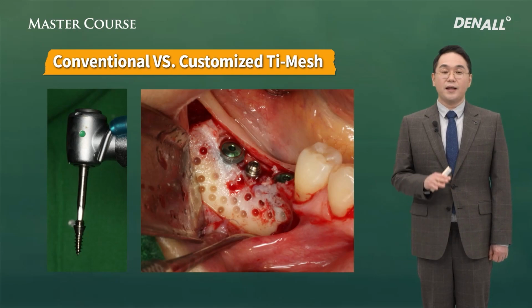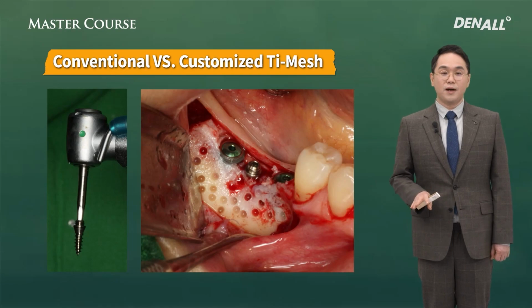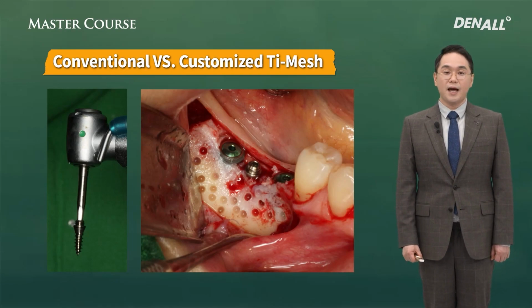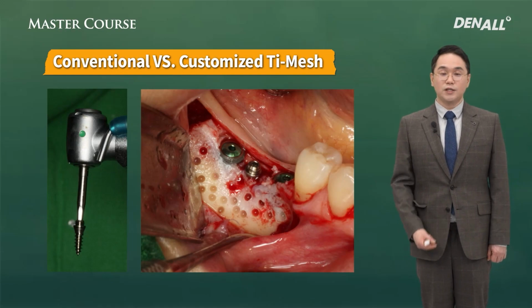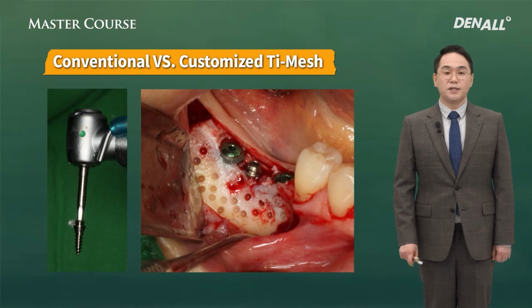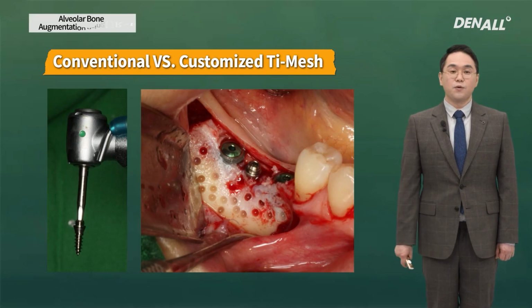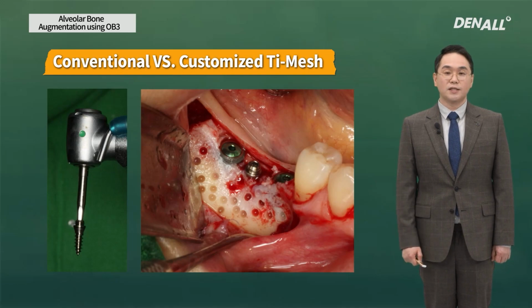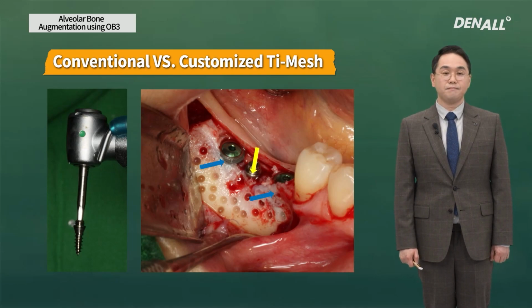The tenting screw's head, where the Jawbuilder will be mounted, should be positioned superior to the cover screws of the adjacent implants. Only that way the overall alveolar bone can be augmented vertically. And the bone graft materials are positioned on the cortical bone where blood supply is poor, so cortical perforation is done.